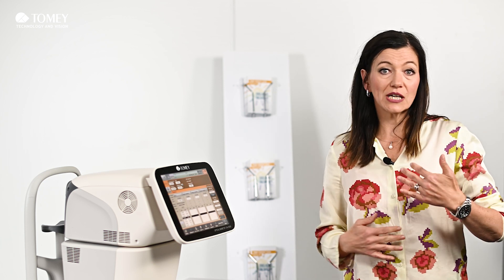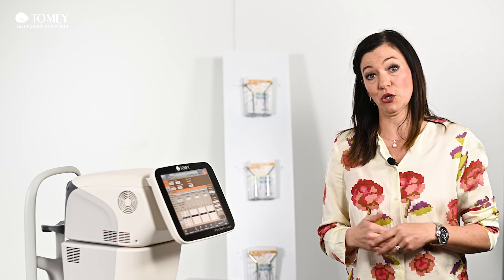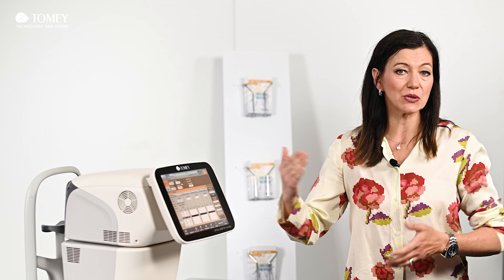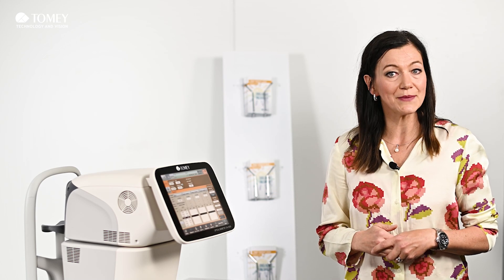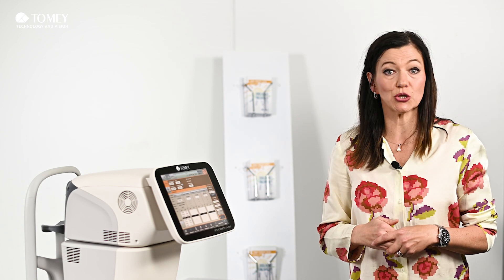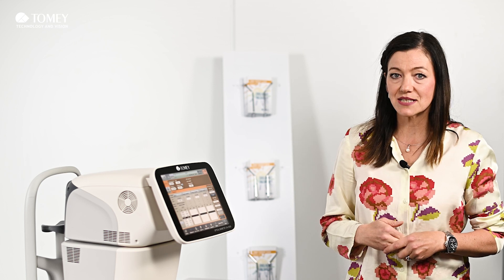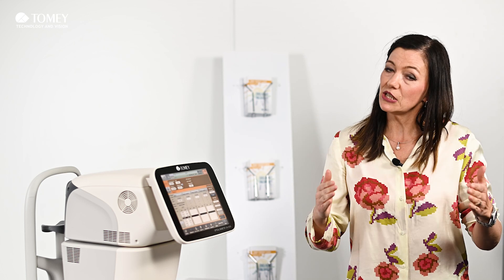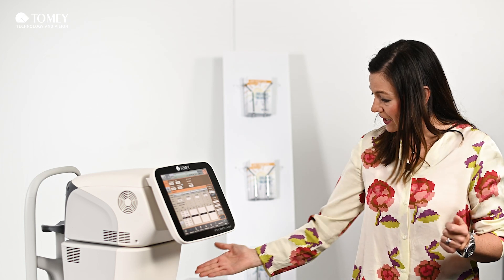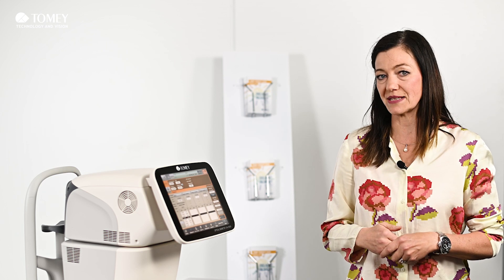So then you can really work on difficult patients with this modern technology, and you have the possibility to import all your favorite IOL models. You can do this from the website iolcon.org, where most manufacturers are listed and you can download your favorite IOL models, put them on a USB stick, and upload them to the machine to suit your needs.